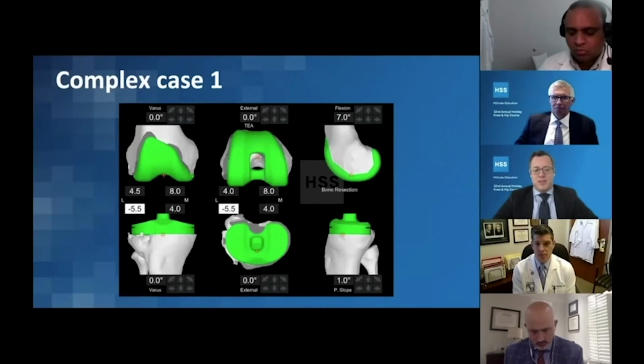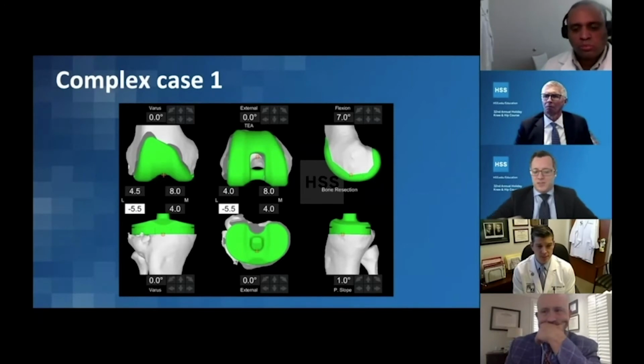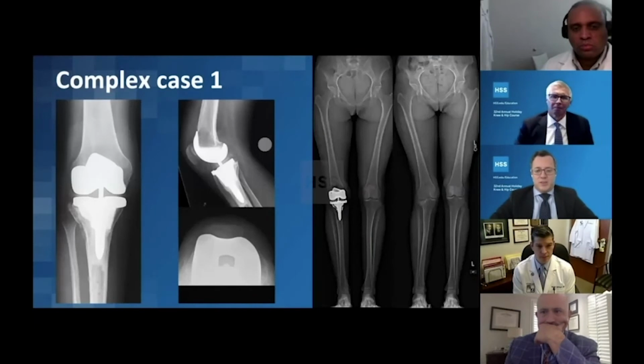You can see once we put the implants on there, there was a very minimal augment that was left there. But the real problem came with her bone quality. That bone did not heal very well. It was all this fibrous bone, so it ended up with a huge lateral defect with only a thin shell of cortical bone. So even though the CT scan looked pretty good, it was a lot of this fibrous kind of trabecular bone. So I ended up putting a cone with a little bit of a lateral flare on there. Short cemented stems just to protect it on the femoral side was okay. So like Brian said, pretty easy to balance her back. She was a little bit lax on her ligaments, so I used a constrained poly on this.